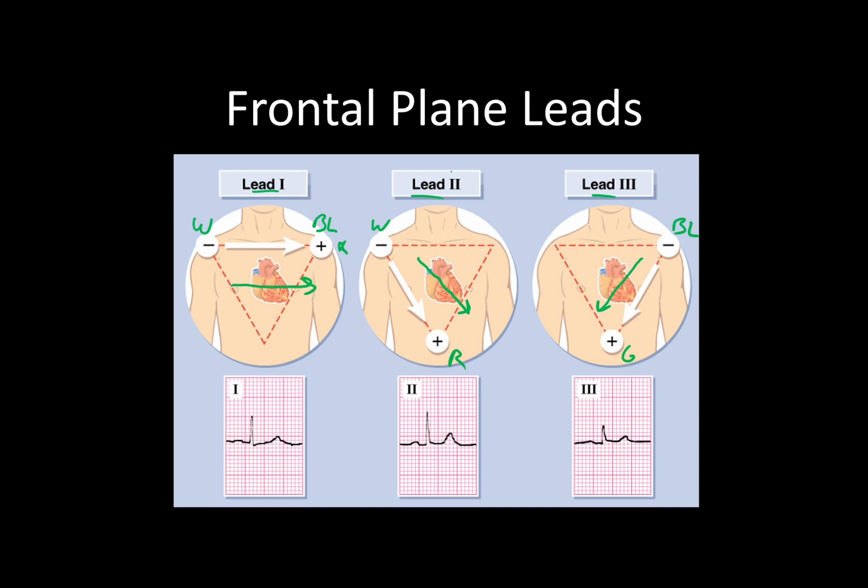You can see why we like lead 2 so much better than the rest, because it has the most general view of the heart. Both atria, both ventricles, their electrical activity is easily seen from its position. And honestly, through the rest of the course, lead 2 is what we will pretty much assume every single strip is in for all of our interpretations with this class.